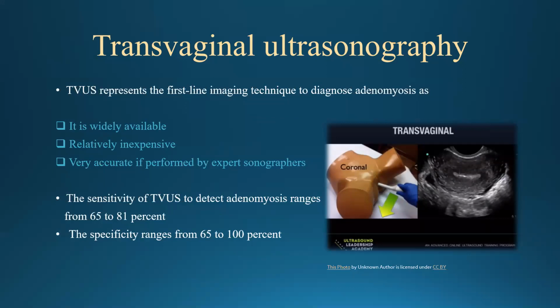Nowadays, the equipment is much cheaper than before, and it's very accurate only if performed by expert sonographers. That's why the workshops and the training sessions are very important to acquire the necessary skills to diagnose.